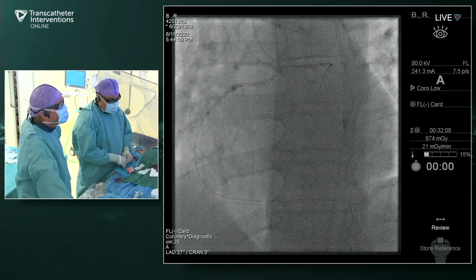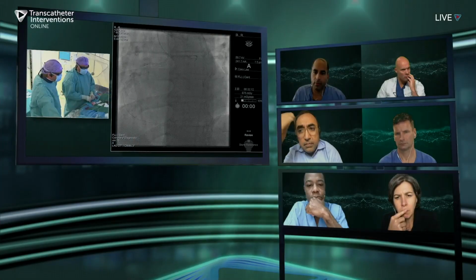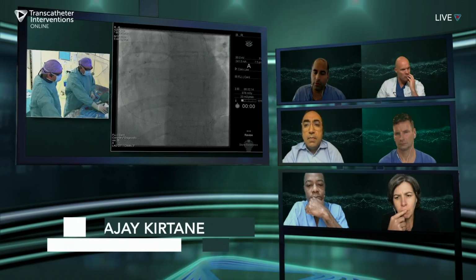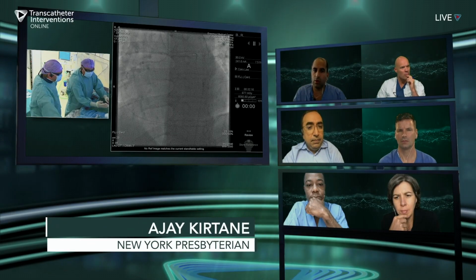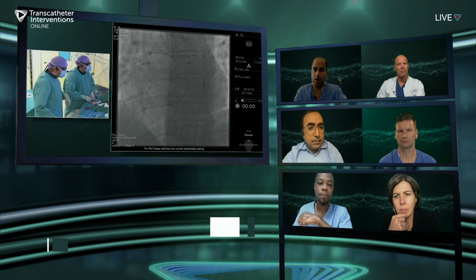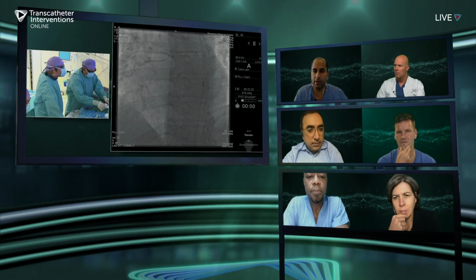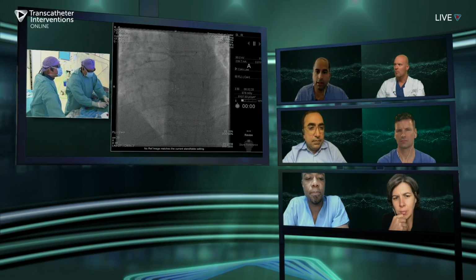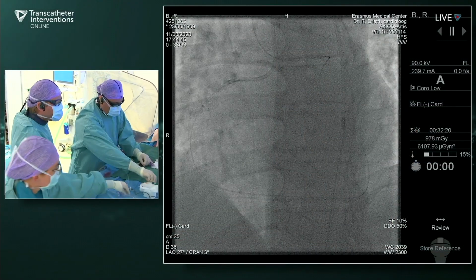The other thing that's important is if you know the orientation of the epicardial when you cross, it's important to get in your mind's eye what that difference is, because sometimes the wire can cheese grate across the epicardial and you won't recognize that until later, and then that's because of a big perf. So just knowing what it looked like and making sure that doesn't change, especially as you're advancing equipment.